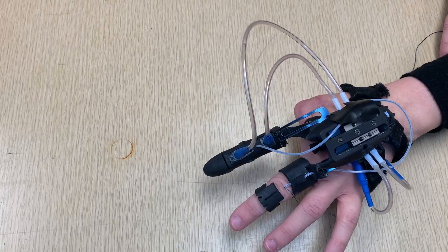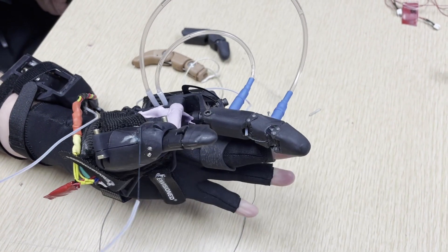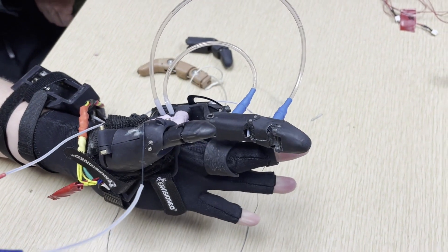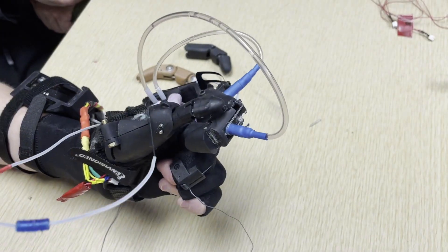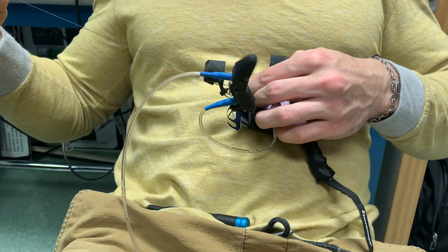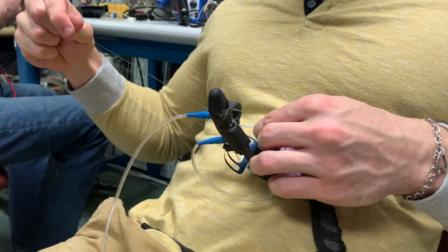The index finger itself is a novel, two-degree-of-freedom, passively-actuated design. Using a springsteel pusher attached to a linear slider, we are able to move the MCP joint of the prosthetic in conjunction with her middle finger. For the second degree of freedom, we use a custom Bowden cable to allow us to jump over her MCP joint and transfer motion from her middle finger's PIP to the PIP of the device.